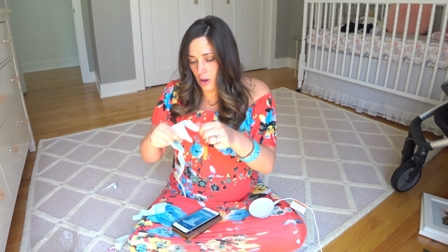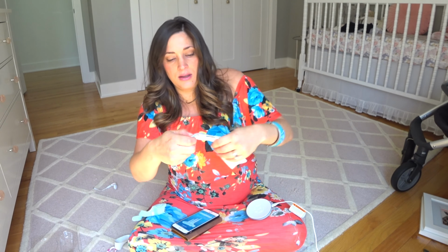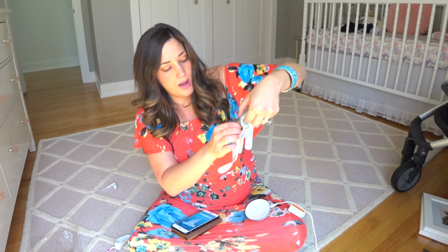Sock guide. Incorrect sock fit can lead to yellow or red notifications. To avoid these, pay attention to the following sock sizing guide. 70% of unnecessary notifications are prevented by correct sock fit. Got it right, people. They're labeled right here. So that says 3, 4 to 18 months. That says 2, 1 to 4 months. And that says 1, 0 to 1 month.